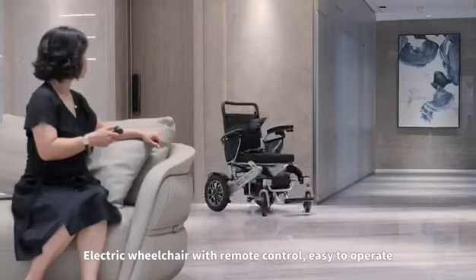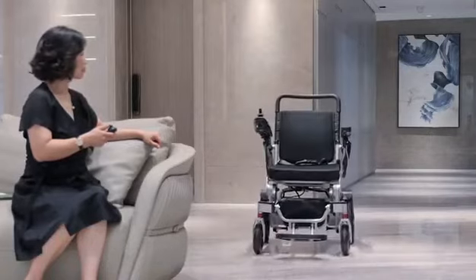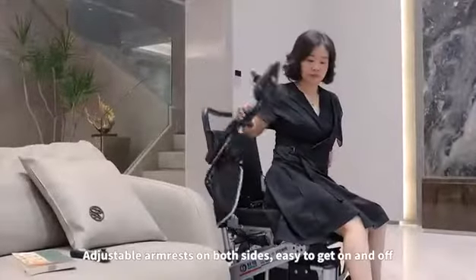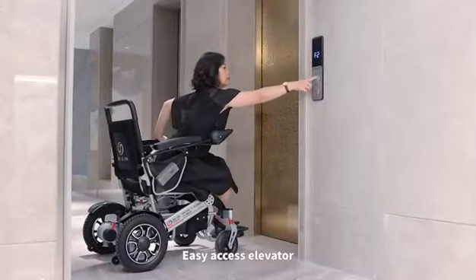Electric wheelchair with remote control — easy to operate. Features adjustable armrests on both sides and a seatbelt for safety. Designed for easy access, including elevator use.